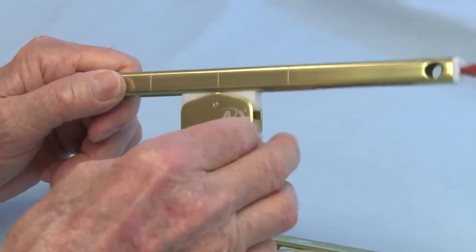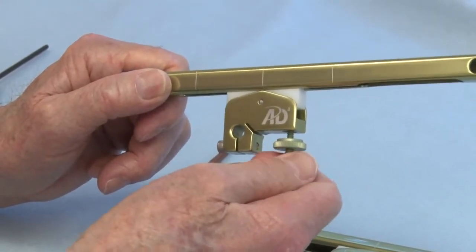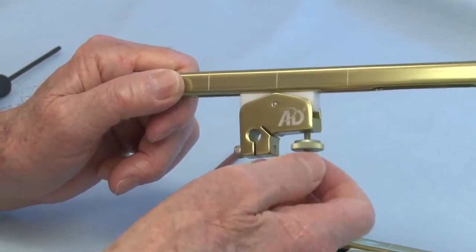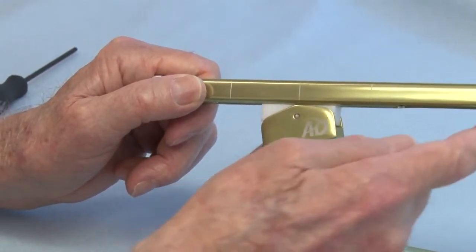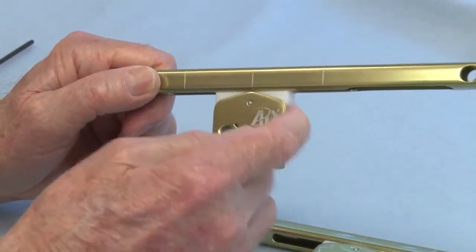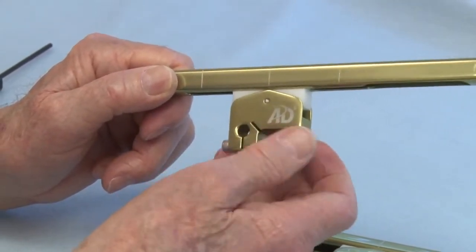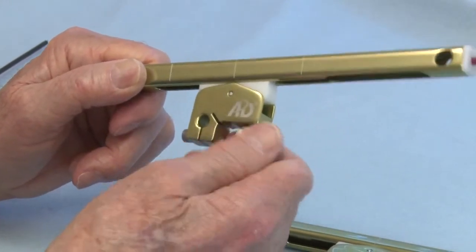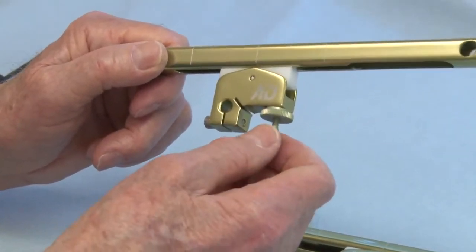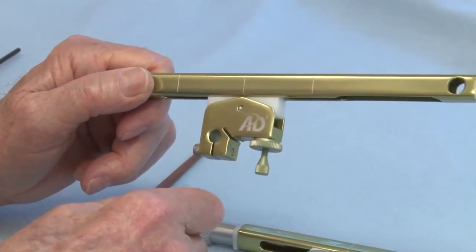Because what we're going to do is that this actually adjusts the vertical position of the stylus, and if I move here, you can see the difference now? So this changes the vertical dimension of the stylus pen, which you'll see in a moment. And when I start out, I like to have these two equal. And then this is an actual lock by changing this screw and moving it this. Let me get it back in position. Now then, I cannot change the vertical. So once I locate the actual vertical dimension I want, then I'll lock it in position.